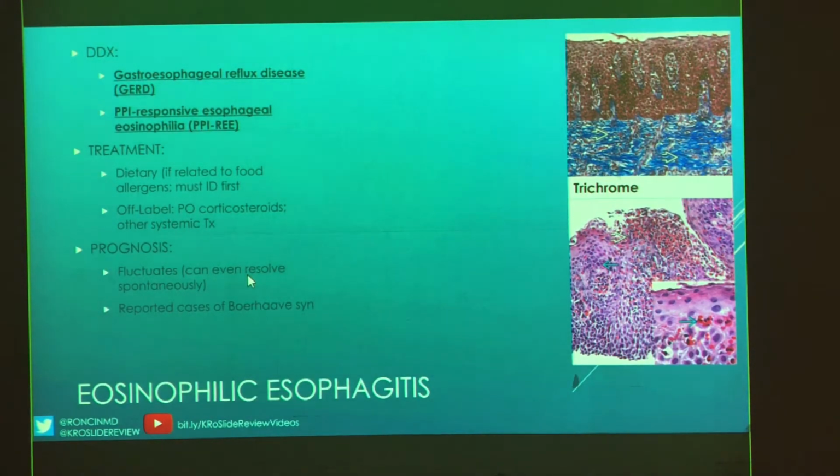Okay, so your differential, not too surprising, is gastroesophageal reflux disease or PPI responsive esophageal eosinophilia. And obviously for the history with that, they would have to have a history of taking PPIs. That's not something that you would just suggest without having clinical history.